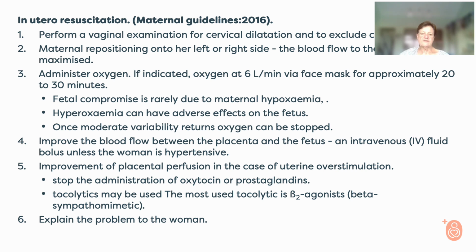The reason we've said that is that fetal compromise is seldom caused by maternal hypoxia. If there was maternal hypoxia because of a maternal heart condition or something like that, we could continue with that. Otherwise, not. Hyperoxemia can have adverse effects on the fetus.